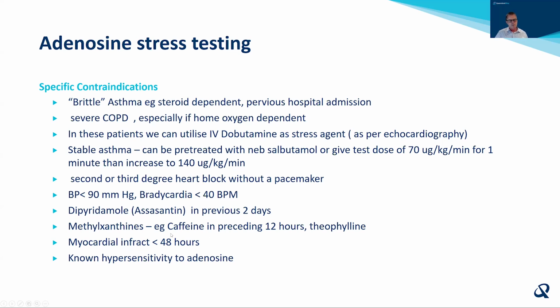The one unfortunate side effect is that caffeine can block adenosine. So patients have to have no coffee or caffeine-containing foods for at least 12 hours prior. I have seen patients have quite severe caffeine withdrawal because of this. If they've had an infarct in the preceding 48 hours, then they shouldn't have any form of stress testing. And rarely, I've never seen a patient have hypersensitivity, but if they've had a history of an adverse event with adenosine, then obviously they shouldn't have it.